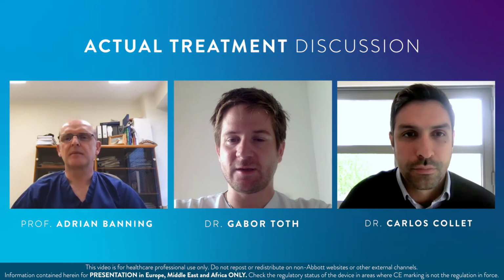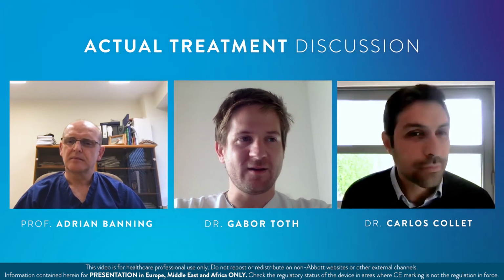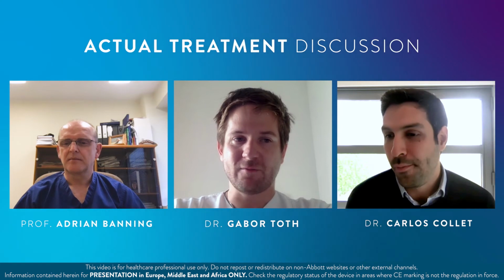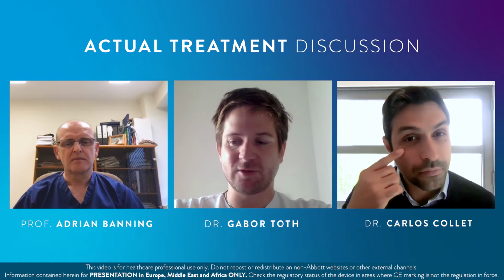Yes, so my question is that you used OCT in the main branch after lesion preparation, but you did not use it after wiring the side branch. And wiring the side branch was extremely challenging, as you demonstrated, with different wires, different techniques. In case of complex bifurcation, my greatest doubt is always whether I wire the side branch properly, or in this case, when you already have a stent in the main branch and a stent in the side branch, I would have fear that I might wire the side branch behind struts or not through the cell I really wanted to.